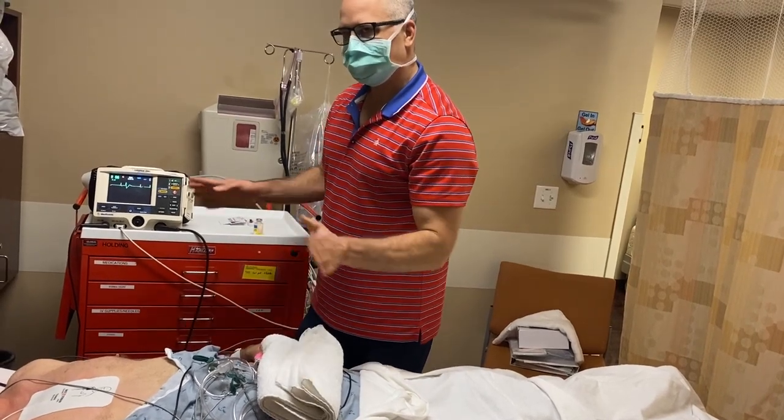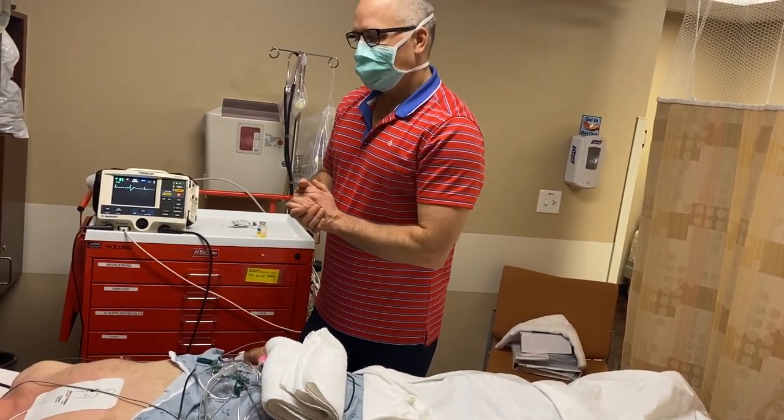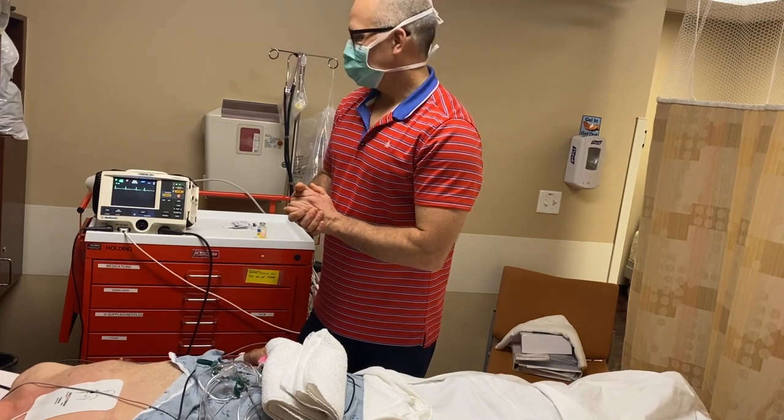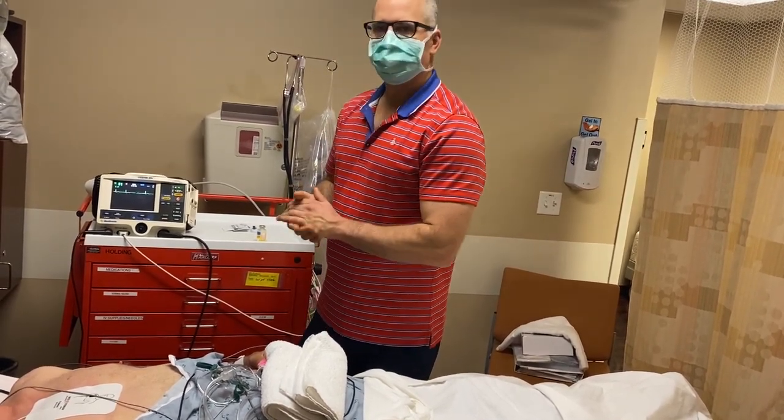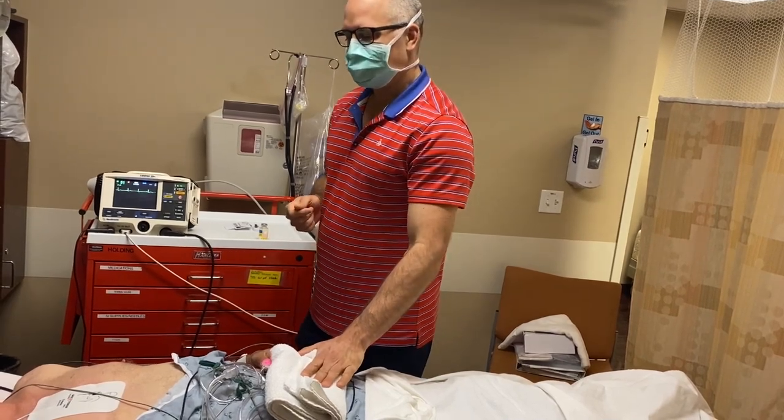So he's in normal rhythm. We'll wake him up and he can go home a little bit later today when he is fully alert. So there we have cardioversion for AFib.